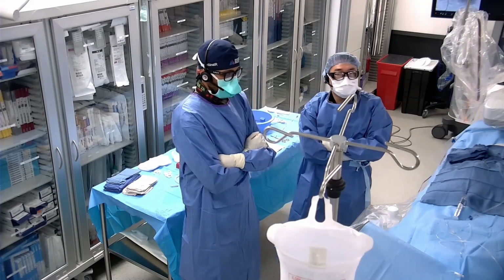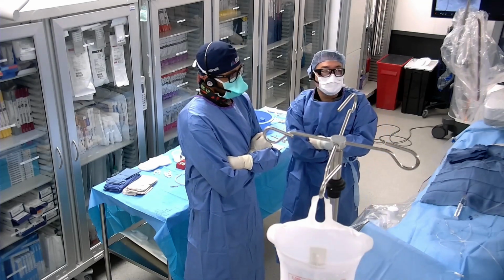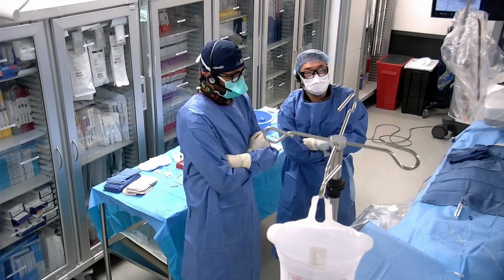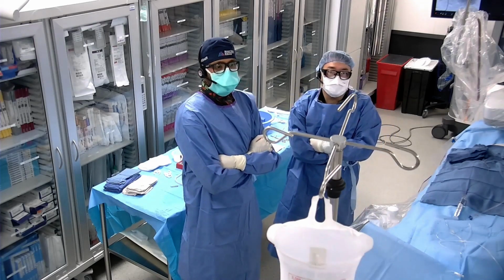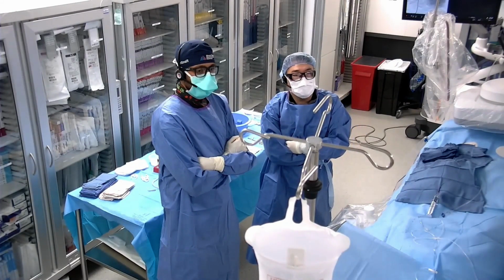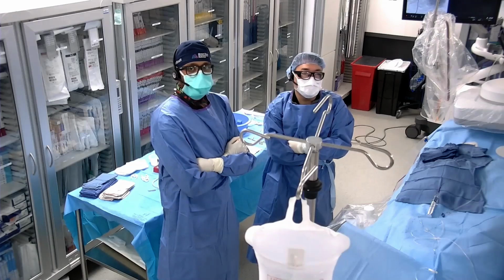We did also counsel and discuss on the location of it, as you had mentioned. It is more distal near the hilum, which could lead to splenic infarct. But to be quite honest, when we spoke with her, we spoke with our referring hepatologist. She has splenomegaly, portal hypertension. It might not be such a bad thing to have a portion of this actually have its blood supply reduced. And so she wanted to go ahead and embolize this.